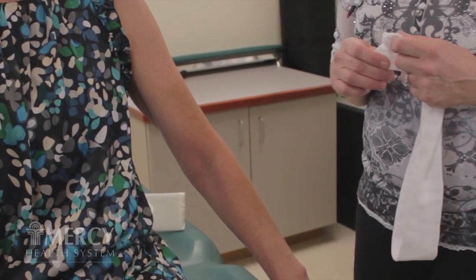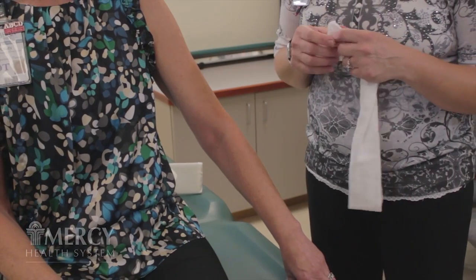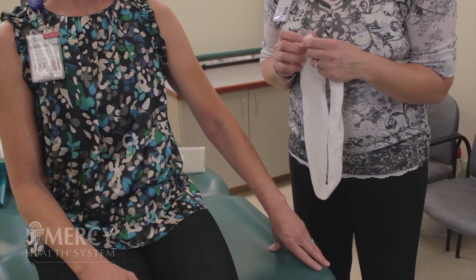The first step when putting your multi-layer bandaging on is to rinse off your skin with a low pH soap. Secondly, you want to make sure you put on a low pH lotion, which will absorb quickly.